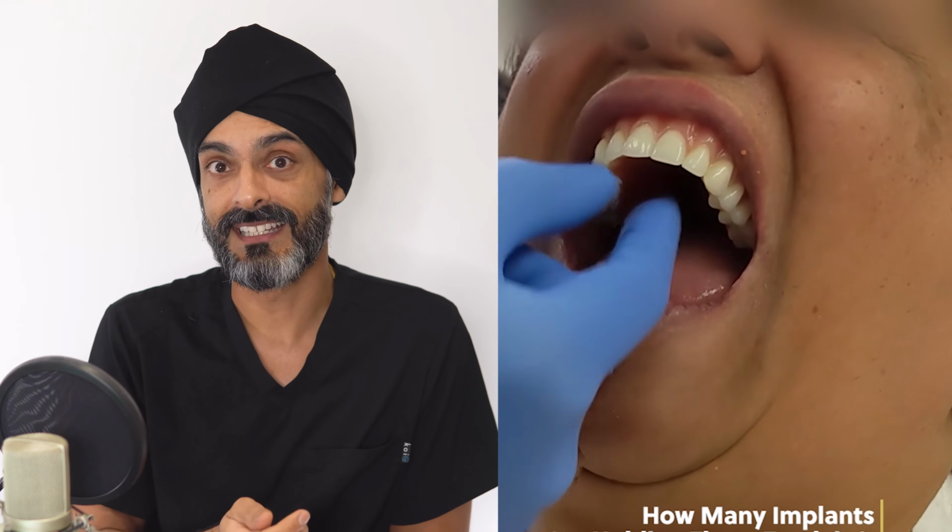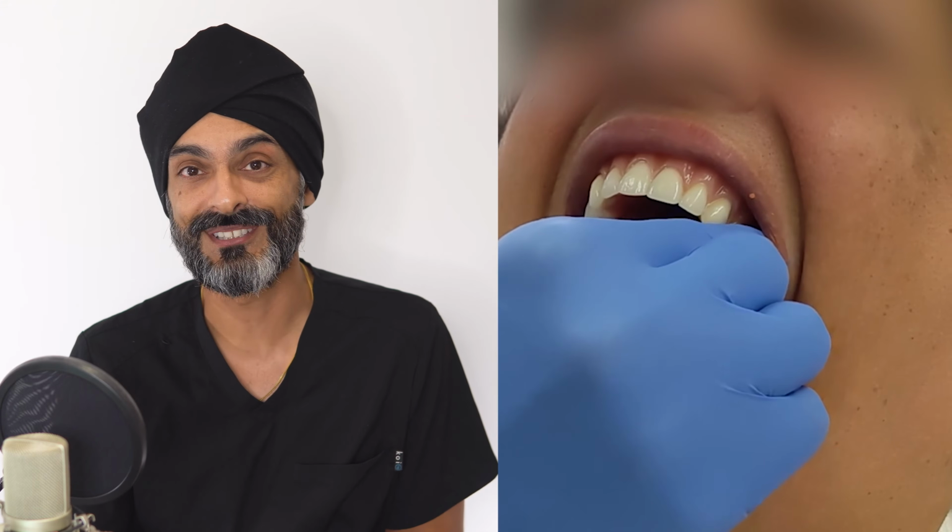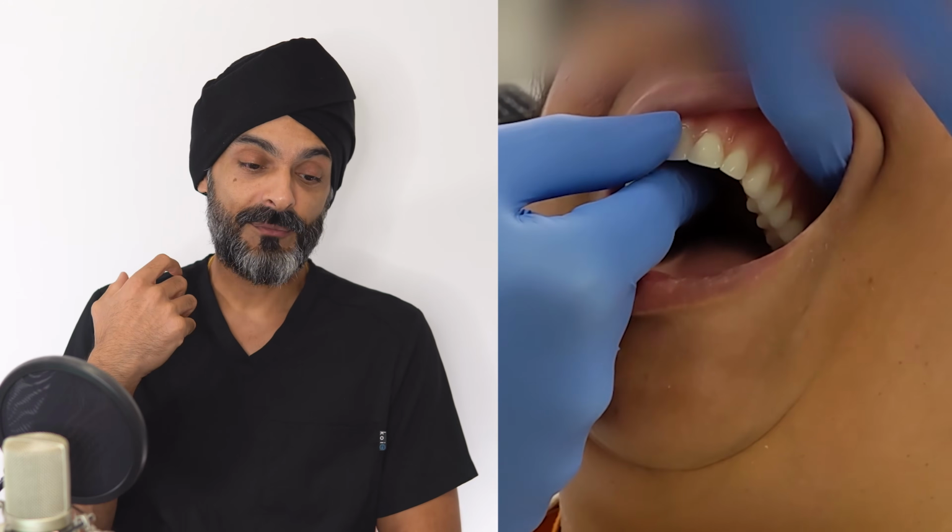Now, removable dentures for some people can be really, really strong. Here's a little video clip of me. I've just relined a denture, made it fit a bit better, and you can feel just by looking at the photo that this is a pretty strong denture. Now, dentures can be made like this, especially top ones. Bottom dentures are notoriously difficult to get on with.